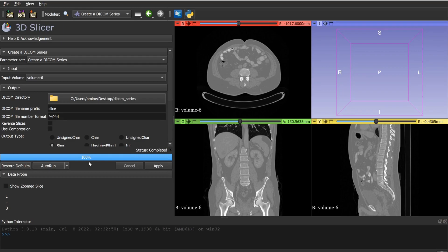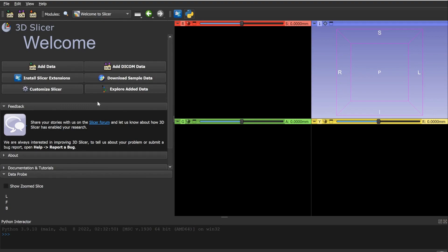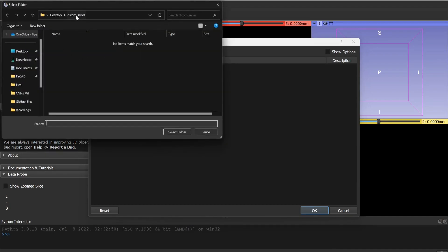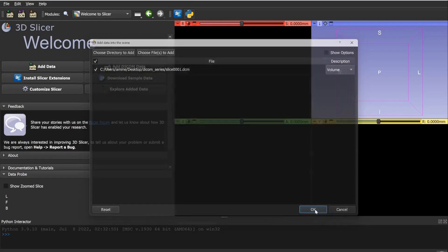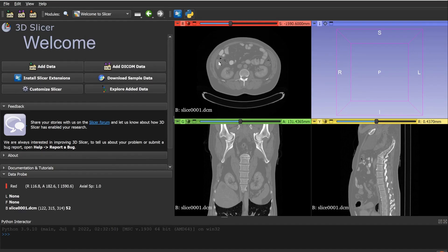To do the reverse — converting from DICOM to NIfTI or NRRD — first close everything and go back to the Welcome to Slicer scene. To open DICOM files, go to Add Data and choose 'Choose Directory to Add', since we have multiple DICOM files. Select the folder containing the DICOMs and click OK. The DICOM series will now be loaded.